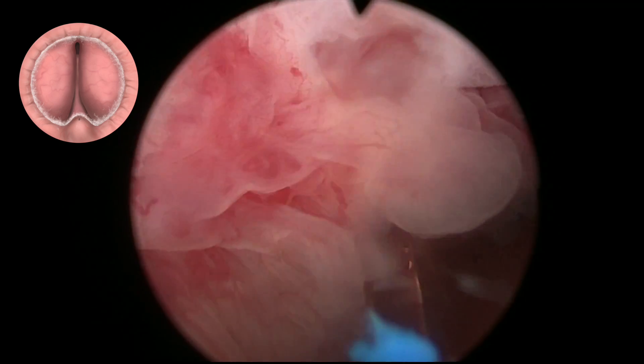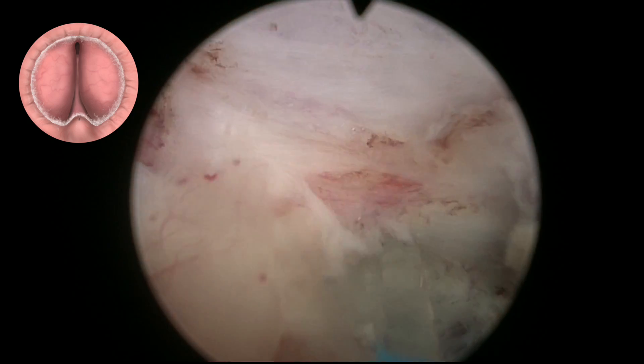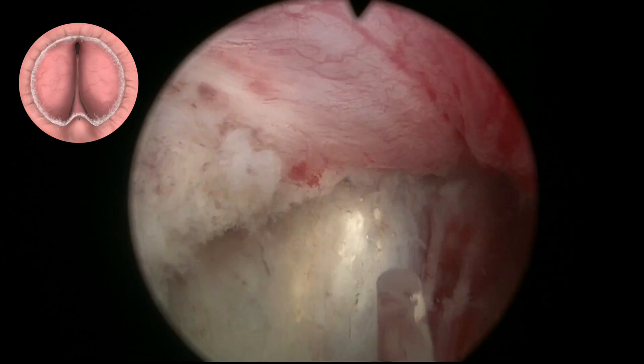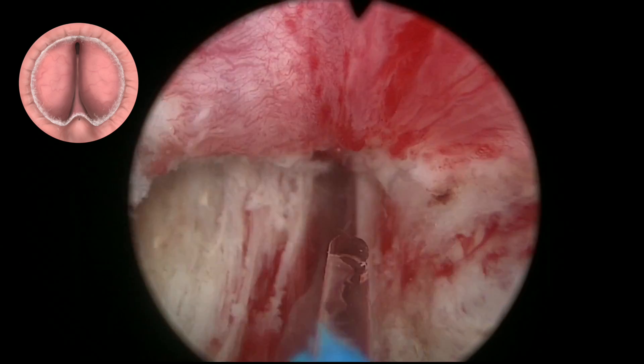This means the mucosa of the sphincter is going to remain attached to the sphincter, providing an excellent sealing effect and excellent continence immediately after the operation.